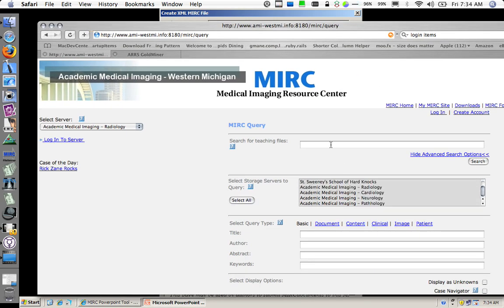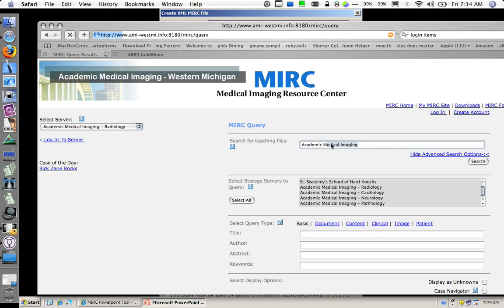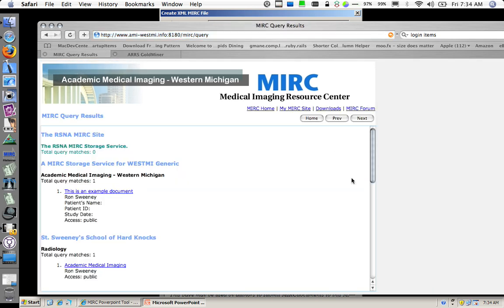I will select all of the storage services and search for Academic Medical Imaging, which was the title of the particular document.